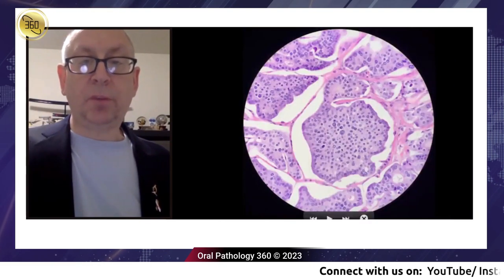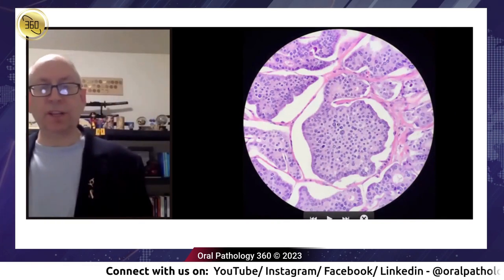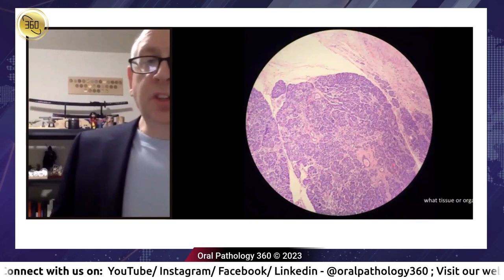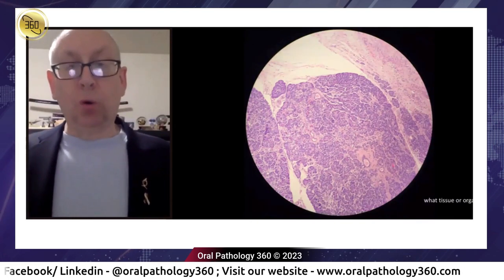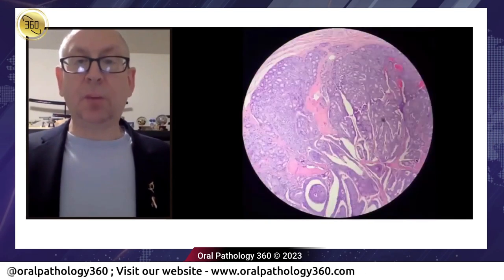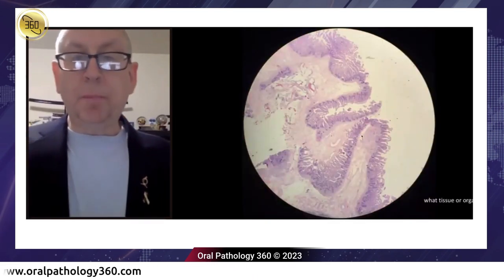This is all the same tumor, some very large cells. So these neuroendocrine tumors can have neuroendocrine atypia. All right, so the question is: I'm going to tell you that we were in the colon. This is actually, go back here, that's colon. If you don't believe me, we'll blow it up.